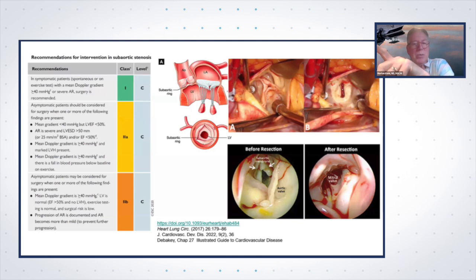And now, just one more word: the teaching for valves is that catheters cross valves and don't prop them open. That is, we measure gradients across pulmonary, tricuspid, everybody, and generally catheters don't create falsely negative gradients. The leaflets coapt around the catheters, we measure the gradients, and we do fine. The only ones that can do that are the really super rigid ones that are almost calcified that you sometimes can prop open. But maybe that's a little bit more of an exaggerated perception. But I think this is very unique in that you were able to reposition it and find your gradient.